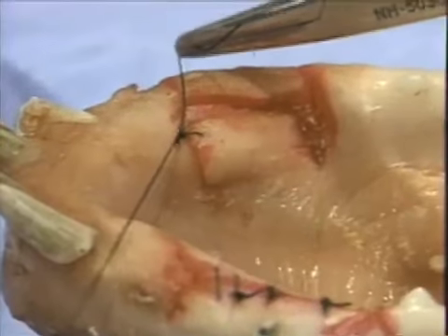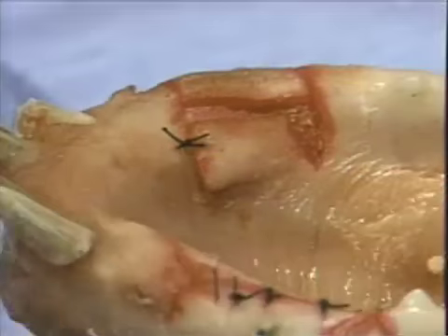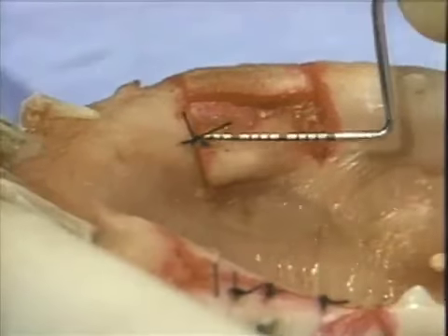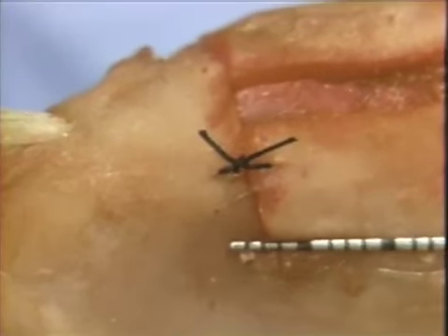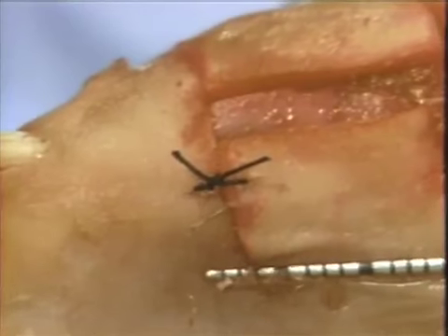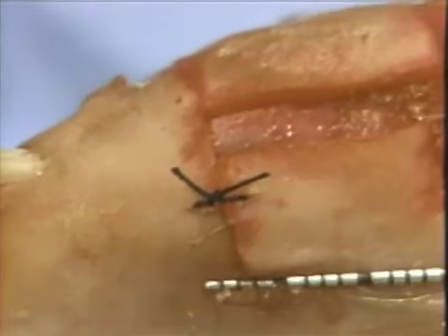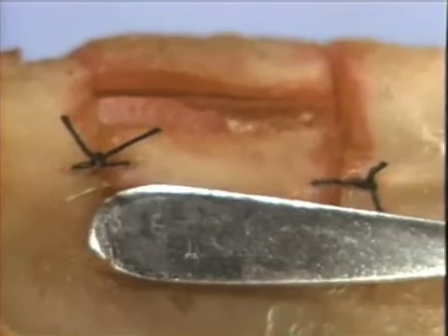The elasticity of mucosal tissue allows the lingual flap to be positioned at this new dimension. This is the basic principle which underlies the apically positioned flap. Hence, vertical releasing incisions and closure of vertical releasing incisions in this manner is frequently employed with the apically positioned flap.